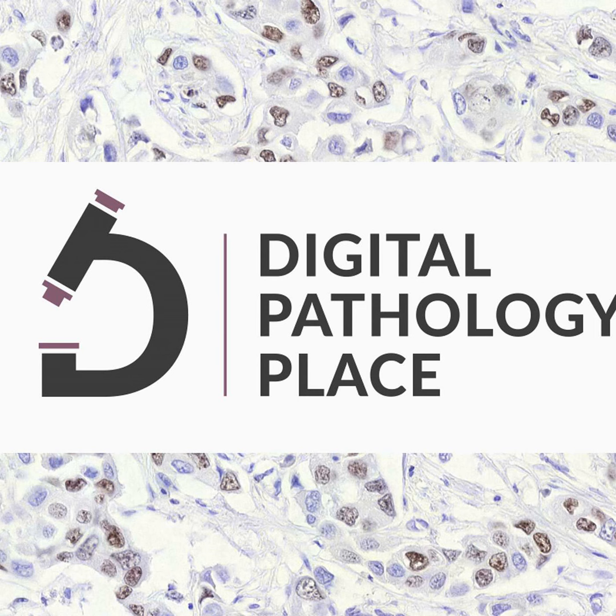Yes, it's supplement 222, and it's called Microscopy Bulk Simple Annotations Storage Subclass, and it was released as final text on the 12th of July this year. So it is fairly fresh, brand new. But it's not rocket science. It's very straightforward. So anybody who already has a DICOM toolkit could easily store and regurgitate these annotations or convert their internal proprietary format to this format in a very straightforward way.